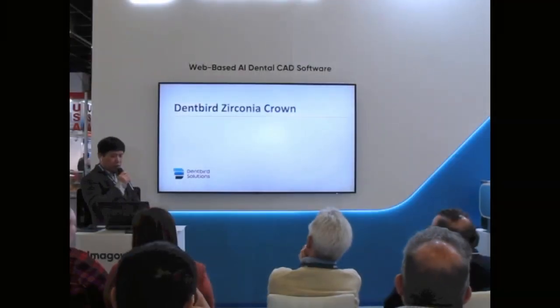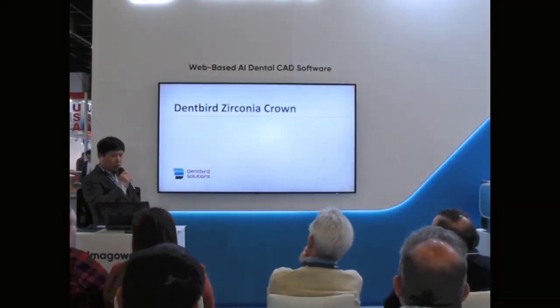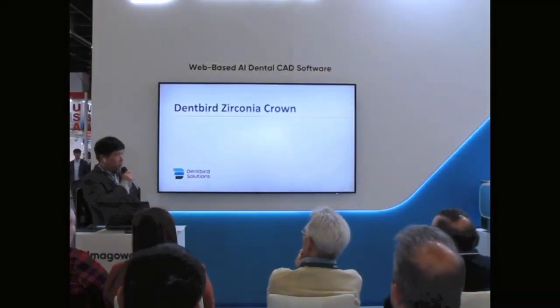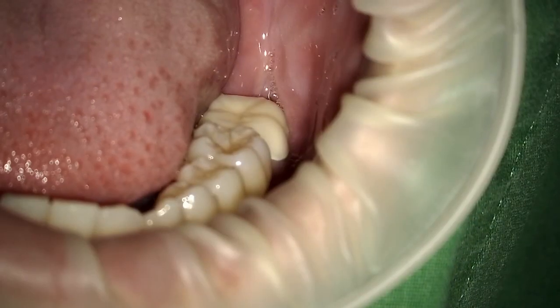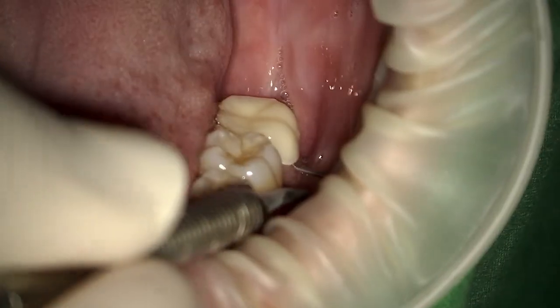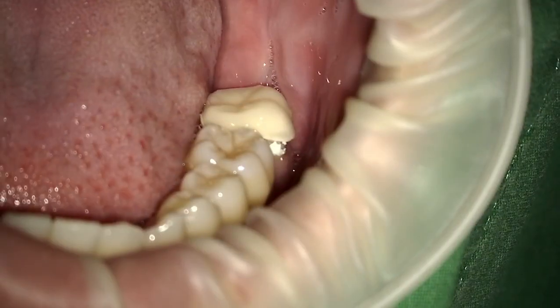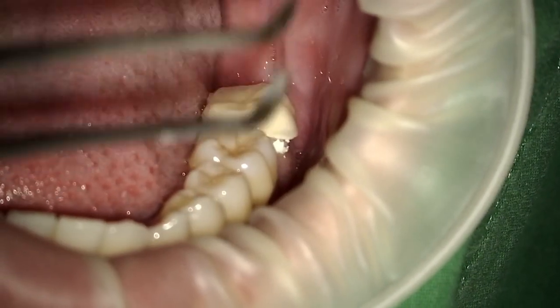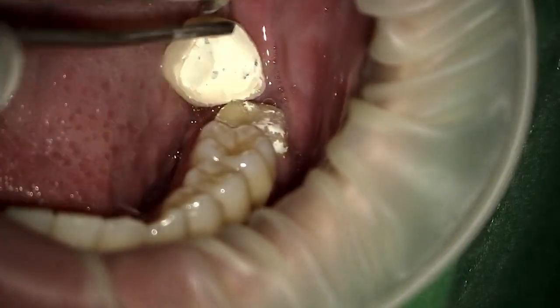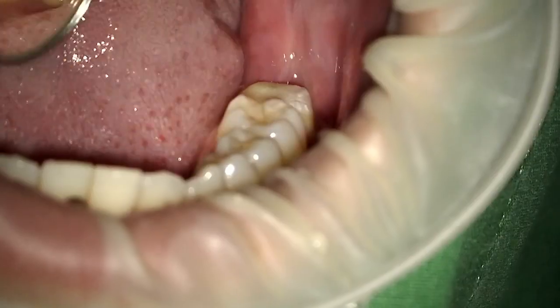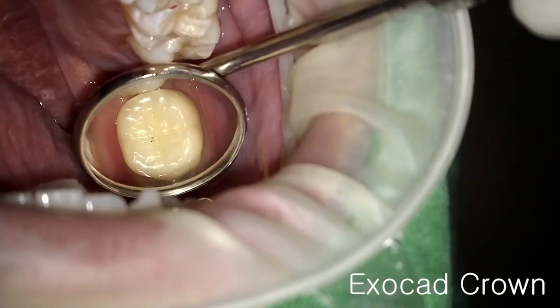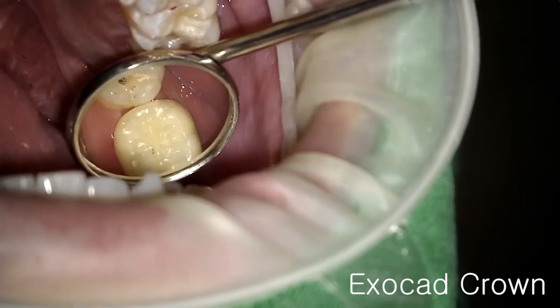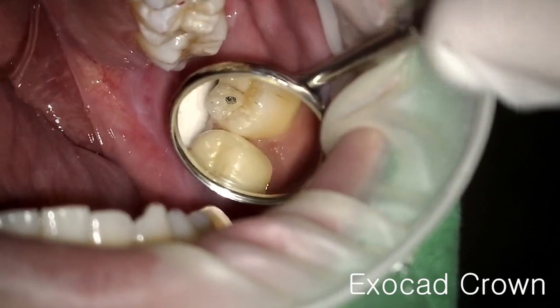Let's proceed with the final seating of the restoration. Remove the temporary tooth and confirm that the inside is clean. Try the final restoration and check the bite.